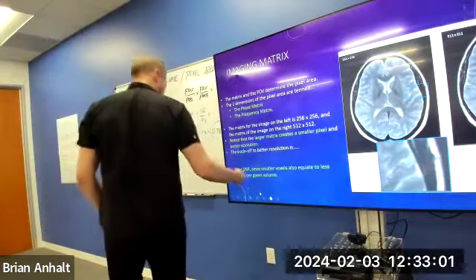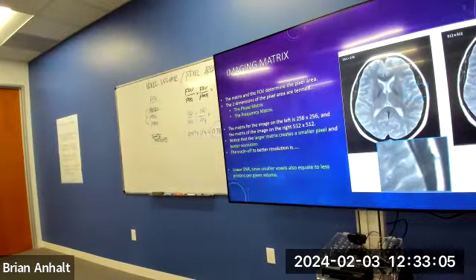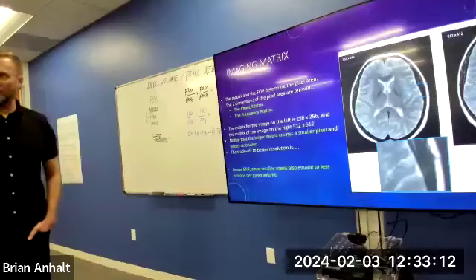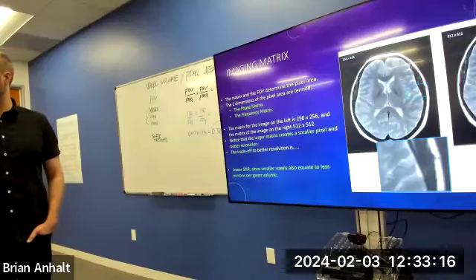The trade-off though is SNR, right? Getting better resolution, your direct trade-off is lower SNR. And it is a 1-to-1 trade-off. So if I want to double my resolution, I'm going to halve my SNR and vice versa.